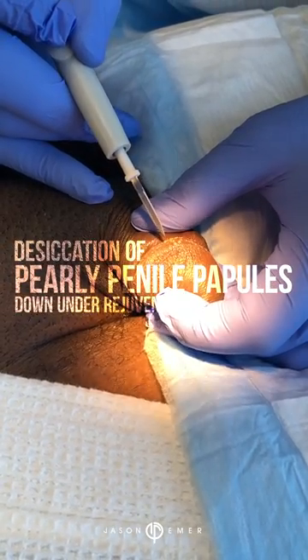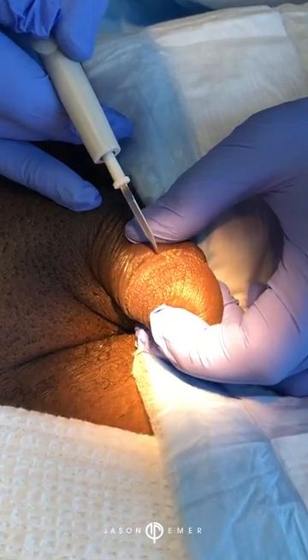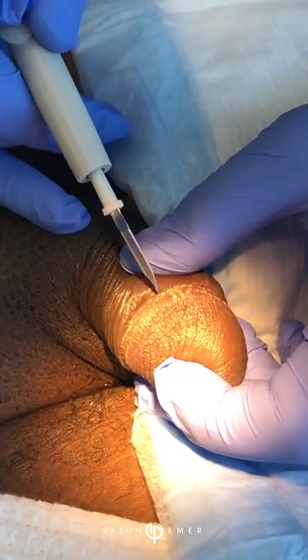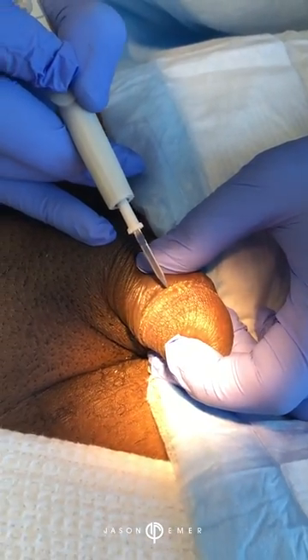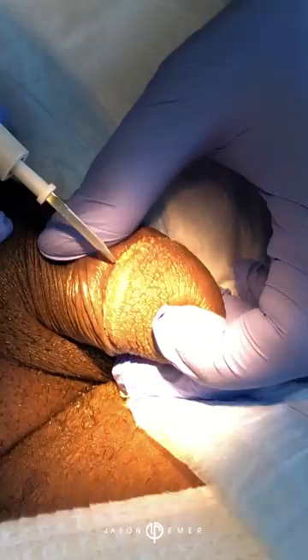We are using a hyfrecator, which is an electric needle, to desiccate these pearly papules on this man's penis. This is a common issue for a lot of men. It's embarrassing to them, and very few doctors actually treat it, even though it's very easy to treat.